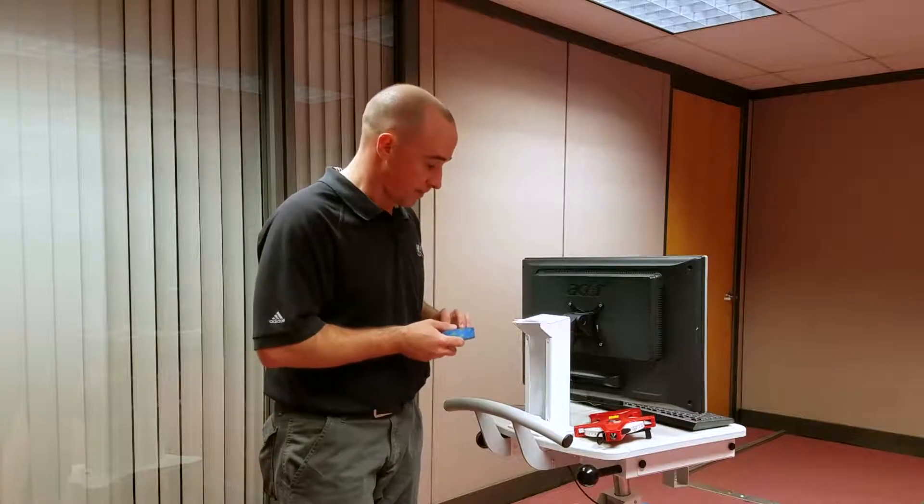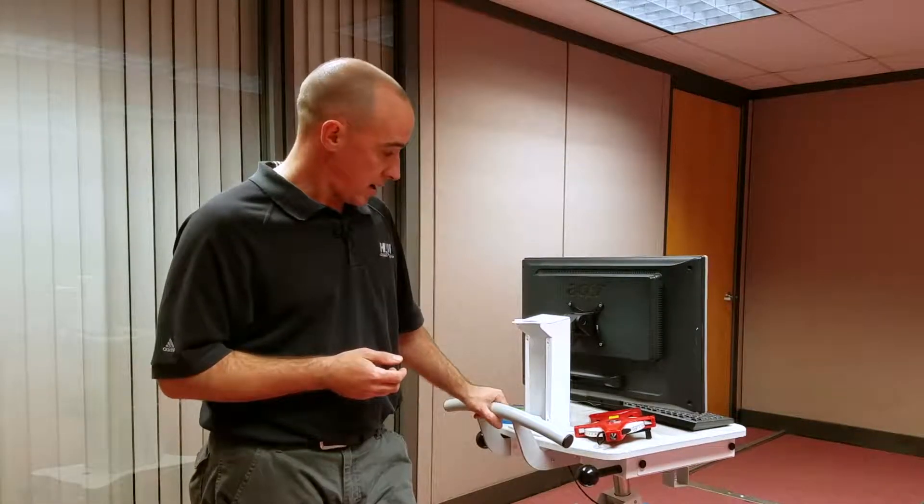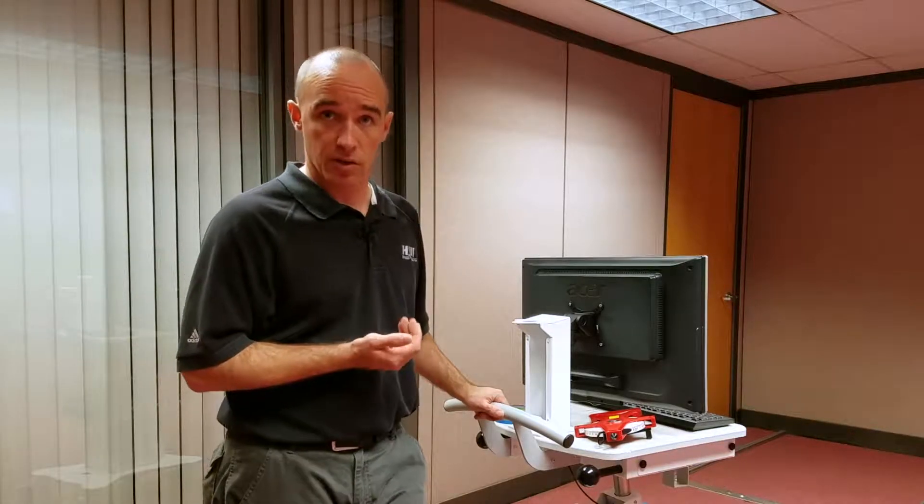I prepare my cart in its transport mode as called out in its instructions for use. And of course, this test only needs to be done on carts that have a mass of more than 45 kilograms. So let's do the test.